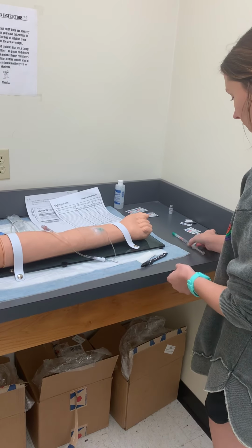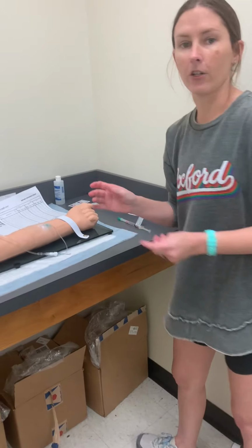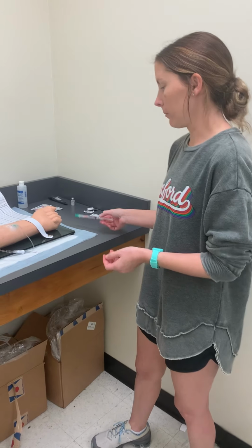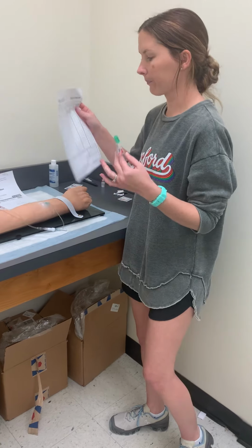Alright. So now I have my medication prepared, and I am ready to go to my patient's room. To my patient's room, I need to take my medication, alcohol pads, and my MAR.